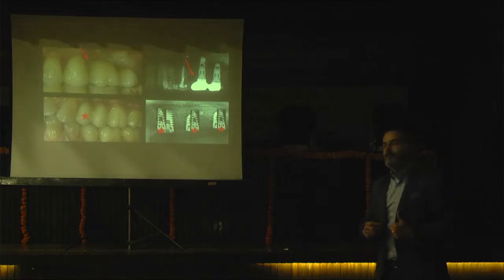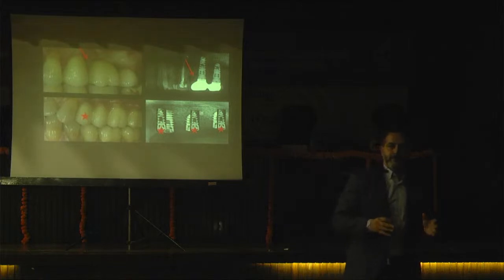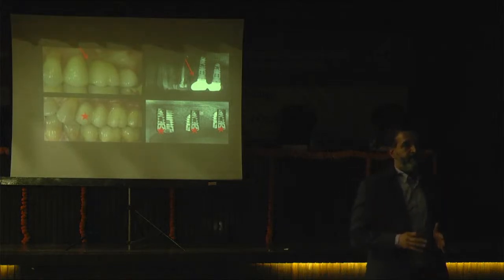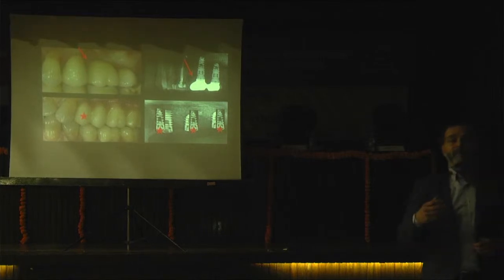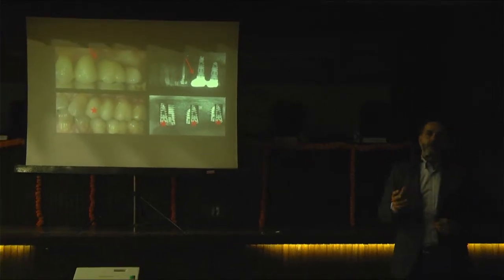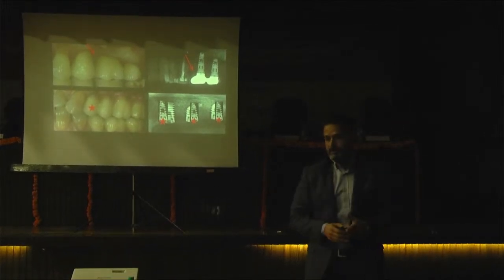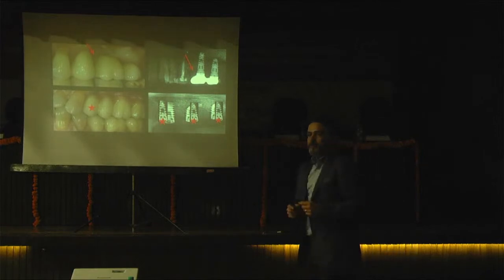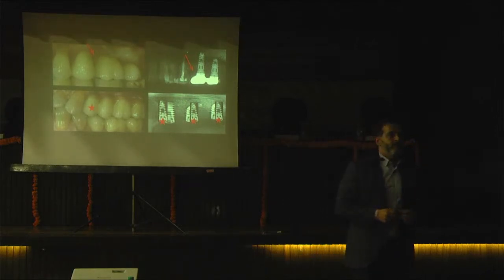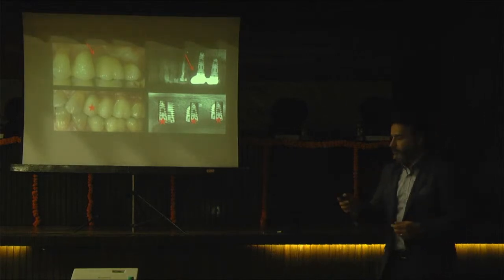But in a guided surgery, first of all, you have to make a good plan, a prosthetic-driven plan, and after that, give the best solution, give the best option, not solve the problem, because it's not a problem. You give a present to the patient. So if they were located in good places, then the prosthesis will be maybe 3 porcelains without any food impaction.